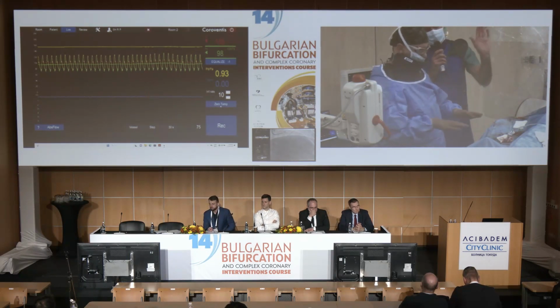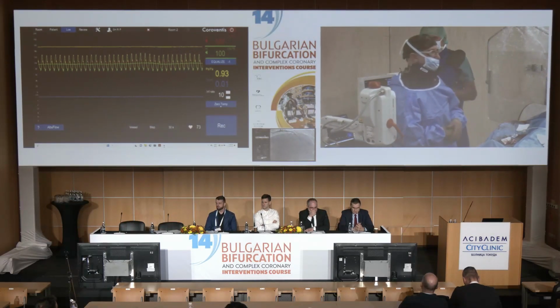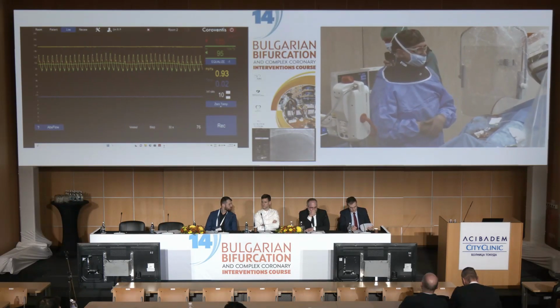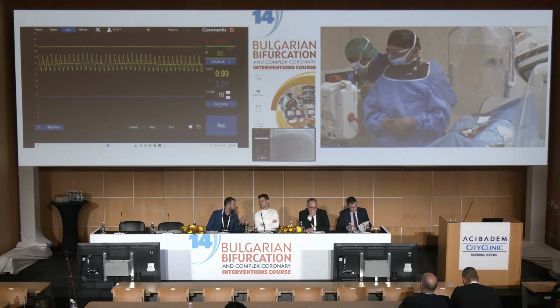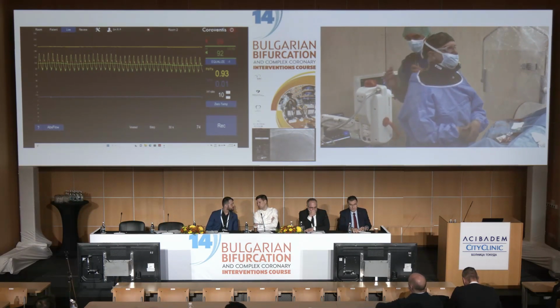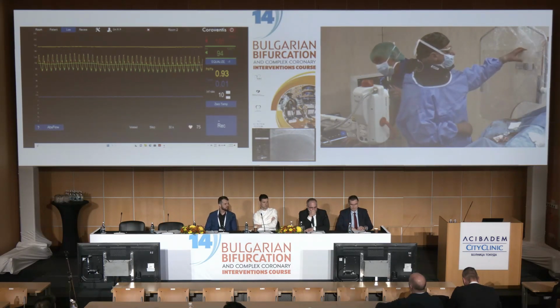So everything is there, and now actually the machine, the pump, is ready to infuse 10 milliliters per minute of saline at room temperature in the proximal LAD. And I will draw your attention to what happens on the screen. And look specifically at this blue line. The blue line is the temperature. So why not start first recording? I will record. You agree?